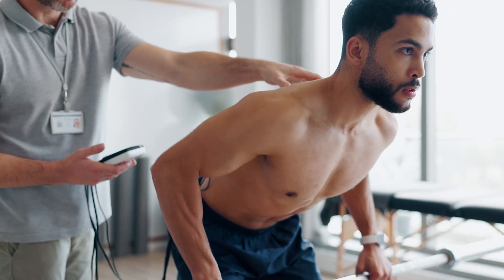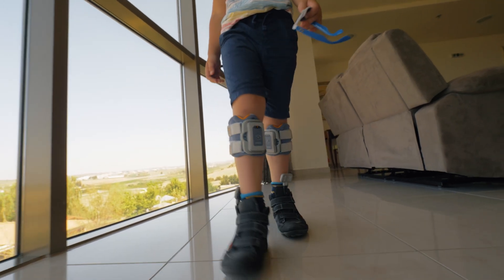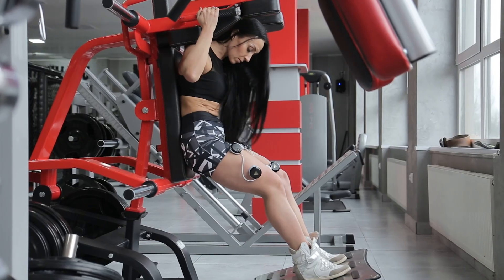There are both sensory and motor applications. In the sensory application, we tend to be trying to address pain, or they can be used when people have neurologic issues and might not feel as well in a certain area — you can use TENS to reinvigorate the sensory nerves. There are also applications where they line up with the motor point of the muscle to actually stimulate muscle contraction. Those units are used with people who've had spinal cord injuries, trying to get different muscles activating and coming back to life.